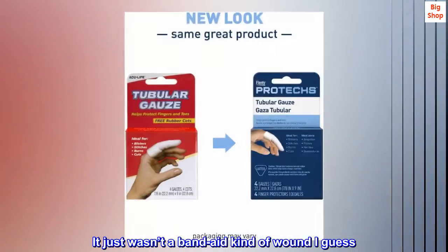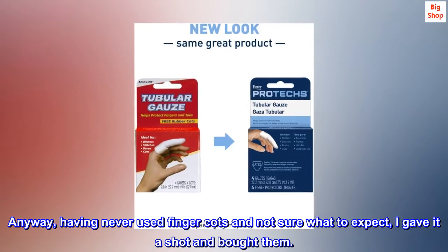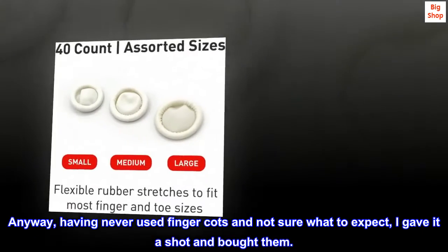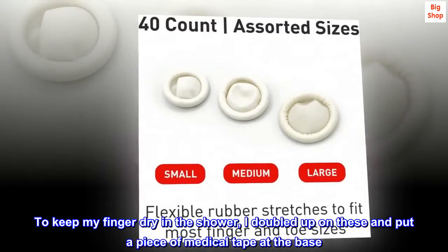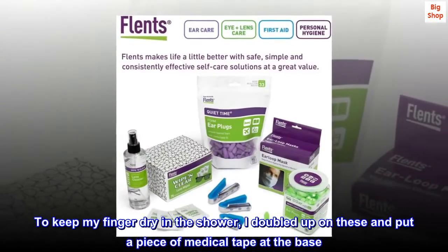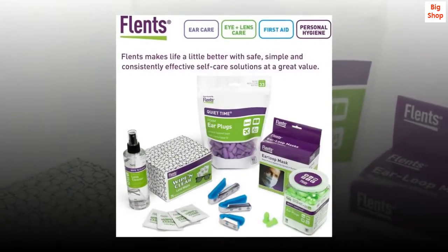It just wasn't a band-aid kind of wound, I guess. Anyway, having never used finger cots and not sure what to expect, I gave it a shot and bought them. To keep my finger dry in the shower, I doubled up on these and put a piece of medical tape at the base. Worked well.